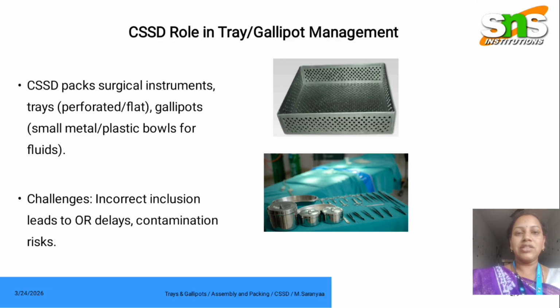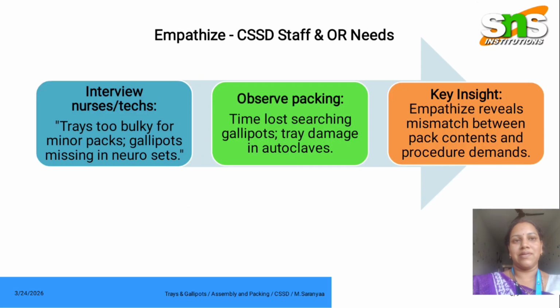What could be the challenge that can occur in using trays and gallipots is incorrect inclusion, which leads to delays, that is operating room delays, and contamination risk. If you place more surgical instruments on the gallipots, it may have a clumped structure. It will lead to an irregular sterilization process.